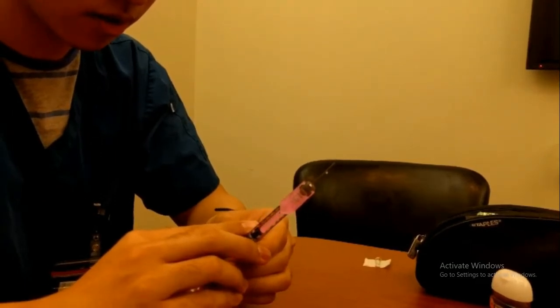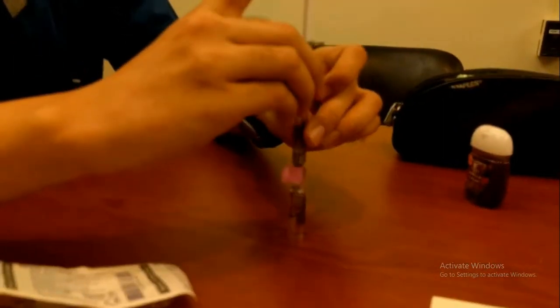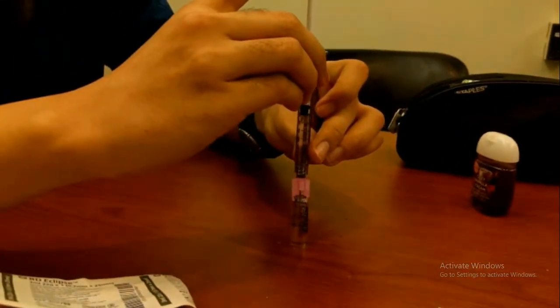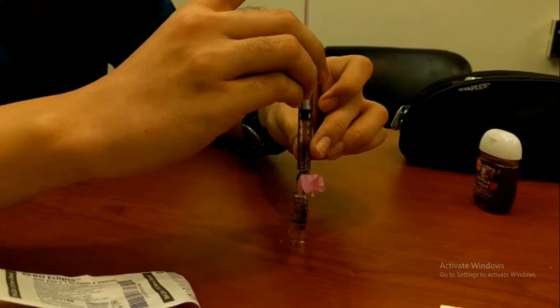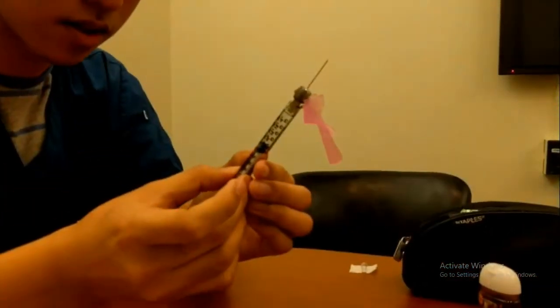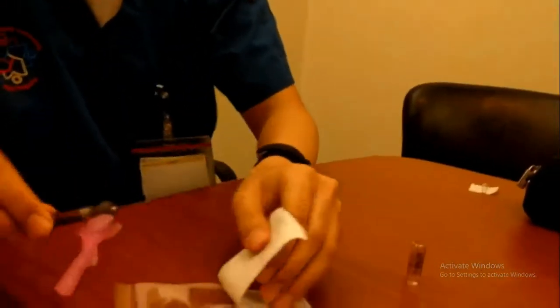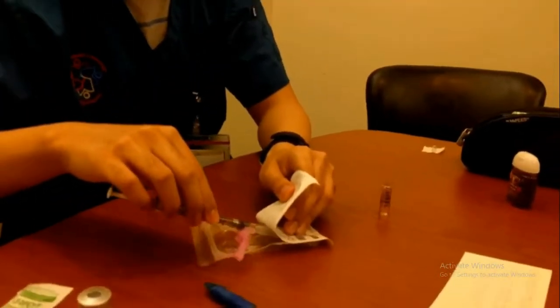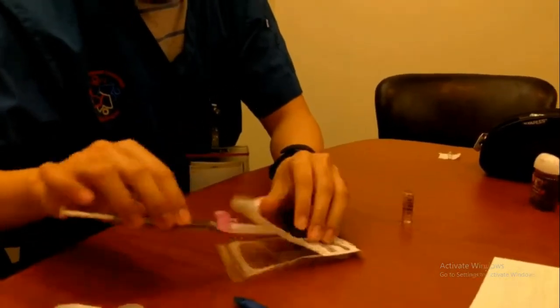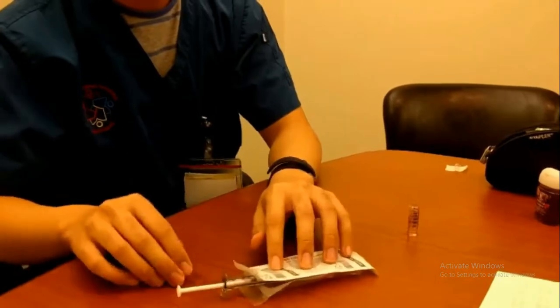Alright, so now that the air bubble is gone, I'll be putting it back in to the vial and expelling the rest of the liquid until it's 0.5 milliliters. Yep. So I checked it over, and so now I'm just going to be replacing it into the cap and re-putting the shield on.